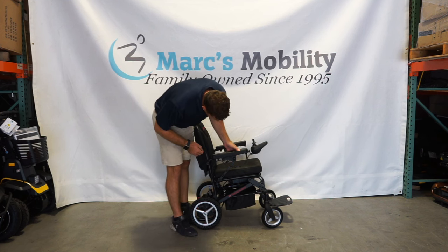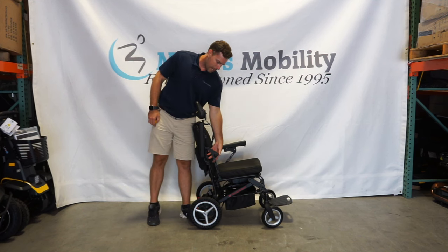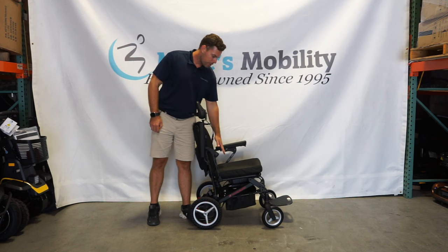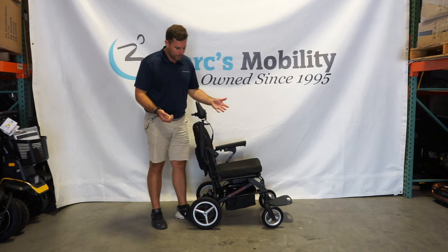The armrests on this unit do flip up. You have a little black tab here on the side. If you press that tab, you can flip the armrests up. Now you do have about three to four inches that this armrest support sticks out, so it is not a flat, straight transfer if you were to use a board to transfer over. But it does flip up so that you can kind of turn and pivot and get out from the side of the unit.